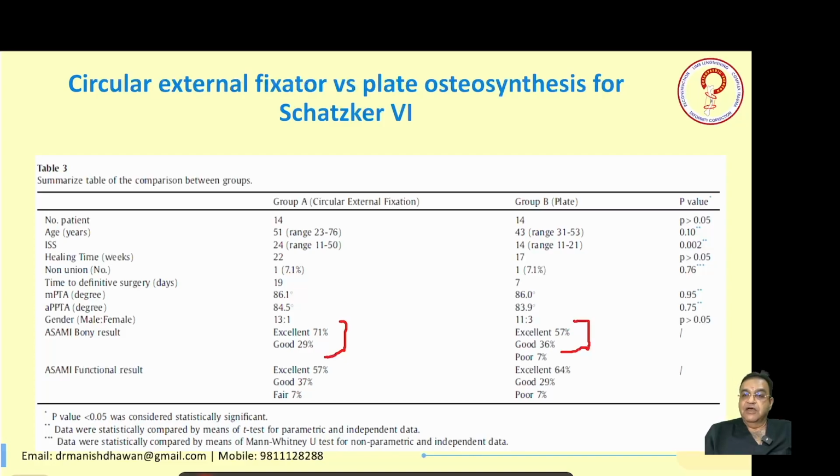It's a minimally invasive procedure. Patient can walk over it. Now if you apply dual plate, you will not allow patient weight bearing, but with Ilizarov fixator, patient can walk with partial weight bearing from the very third day or when the pain reduces.